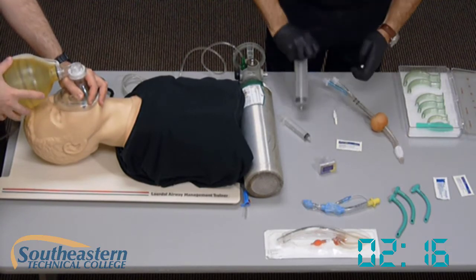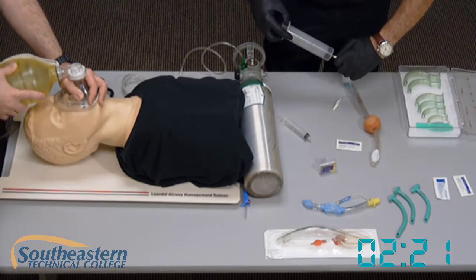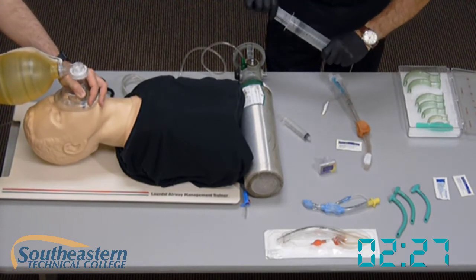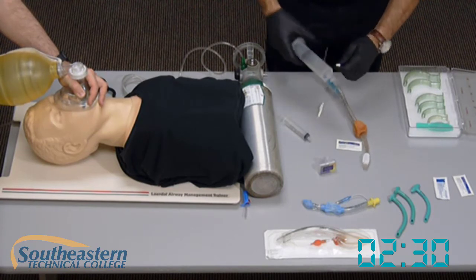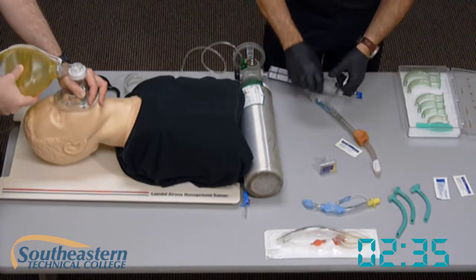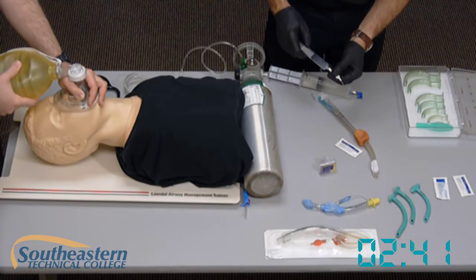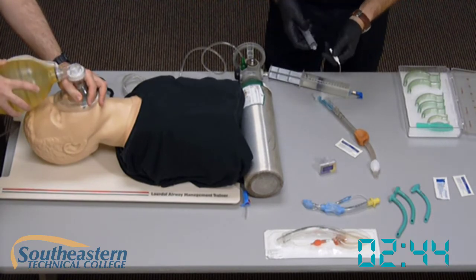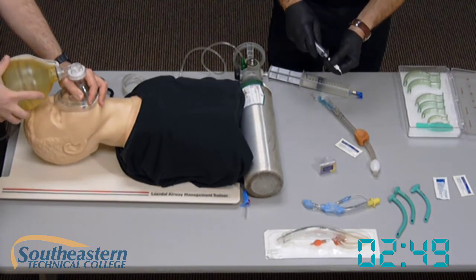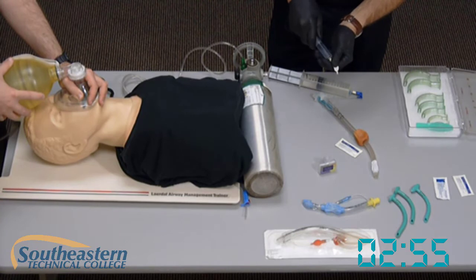I'll inflate the bulb, check to make sure it remains inflated, and then draw the air back out. Reset to 100 milliliters and reattach to the number one port. Inflate the number two port with 15 milliliters, make sure that it stays inflated, withdraw the air, reset at 15 milliliters, and reattach.